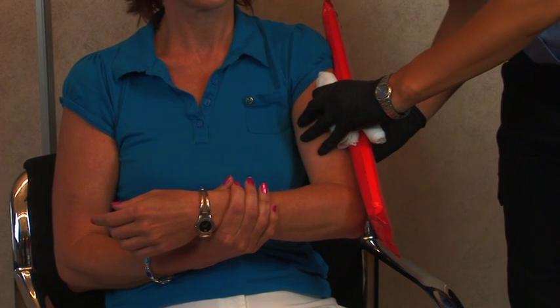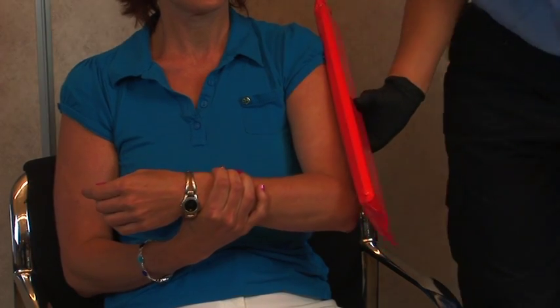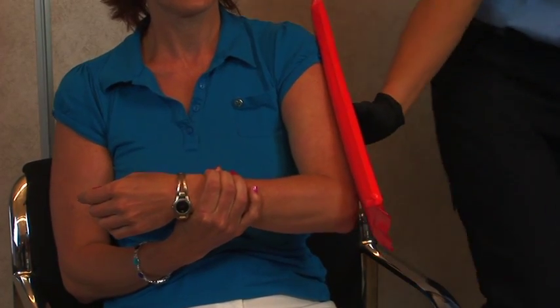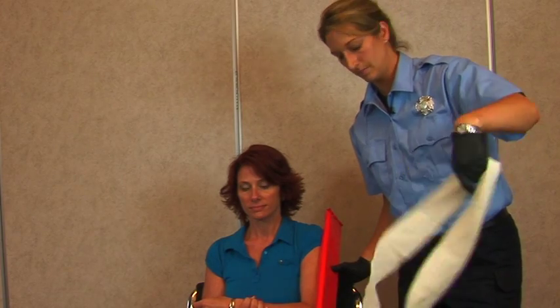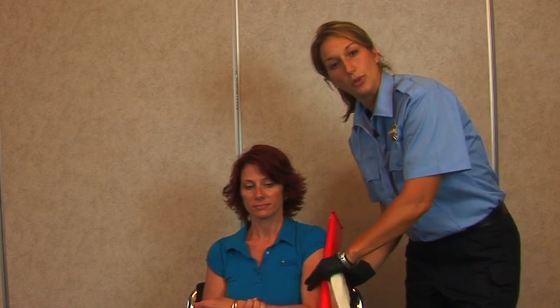You can use several different things to actually wrap around. In this case, I'm going to use triangular bandages. You want to make sure that the splint itself goes from the joint above the break to the joint below the break.